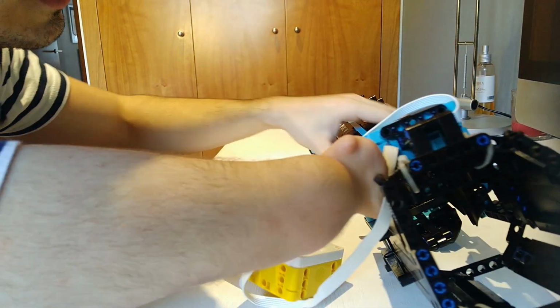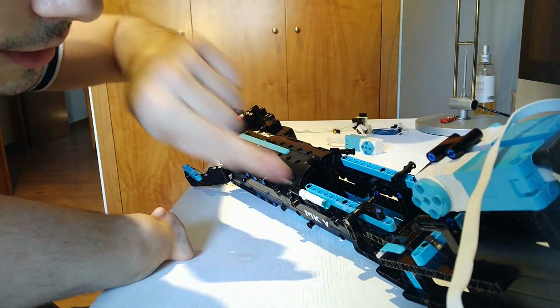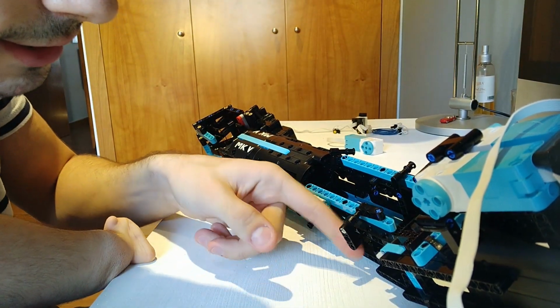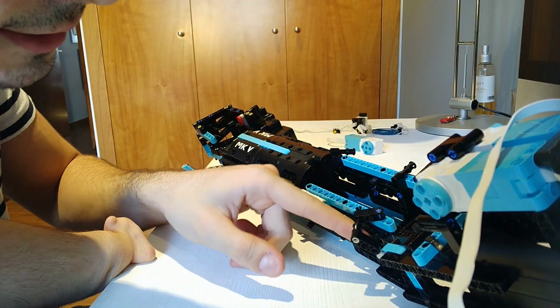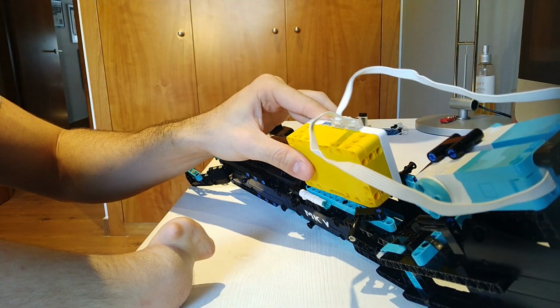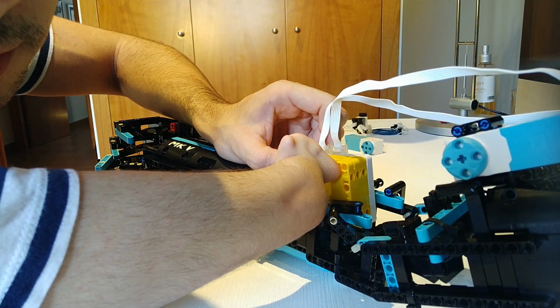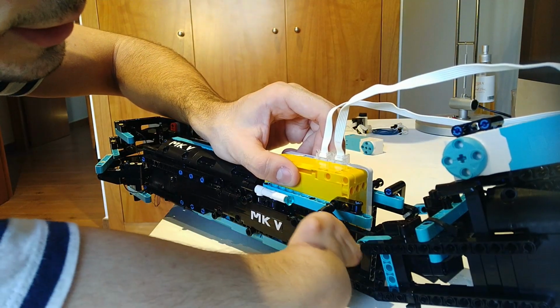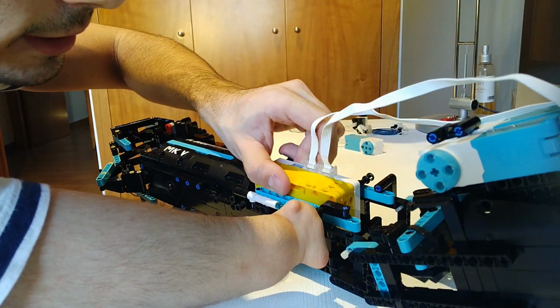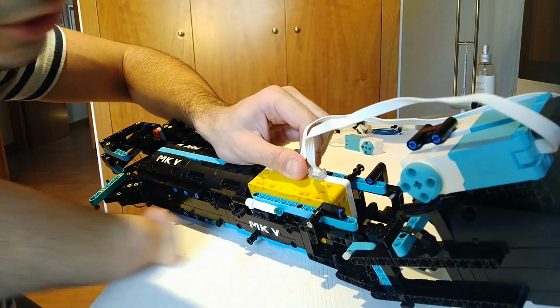Okay. The next step is to grab this part right here and pull it outside. So it looks like this. Now we can move like this. And we are going to put the hub with the connections looking on top. Now you can see this little connection right here on top of the hub. And you need to connect it to the part that we just moved. And it has to be completely aligned so it fits perfectly. It should look like this.